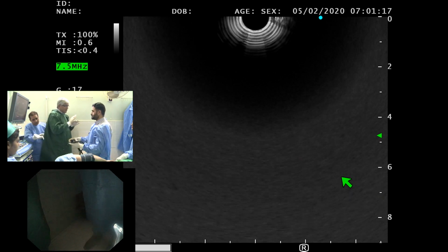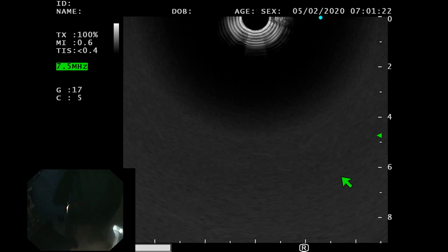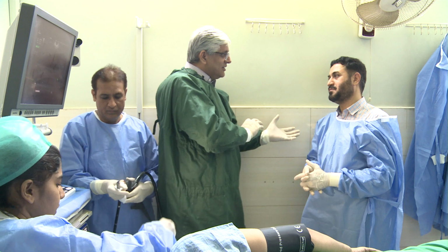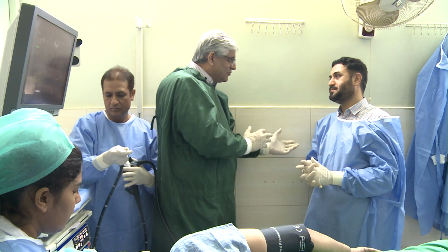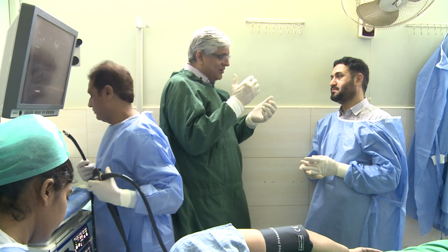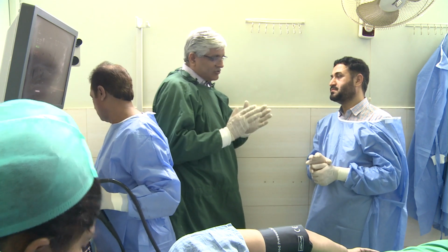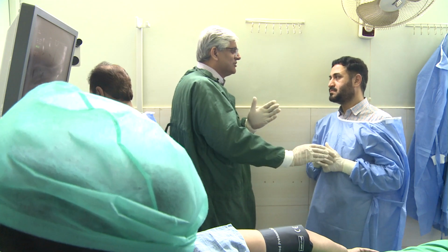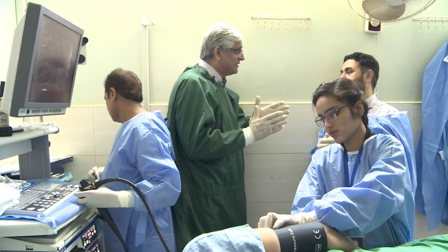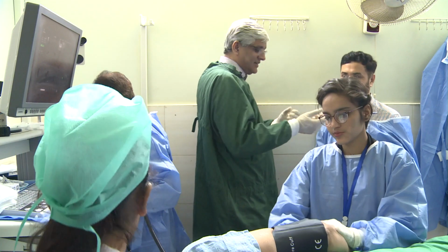It is not about completing the scope here, because obviously if you can complete this, then there is no issue. It's about understanding the clockwise and anti-clockwise movement. It is about making sure your tip is up enough. It is about knowing what happens when you have tip up and what happens when your tip is down. It's also about knowing what happens when you advance the scope and when you pull back the scope. So this is your chance to understand those things. Once you've got the fundamentals, the pictures and things, obviously with experience, everybody will use. Simple things.